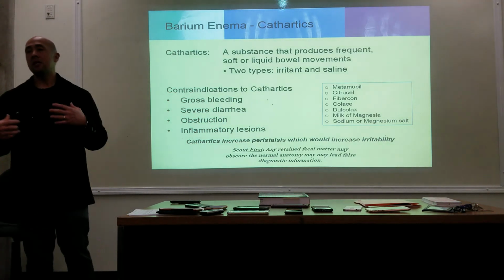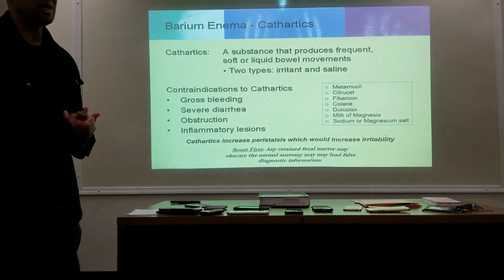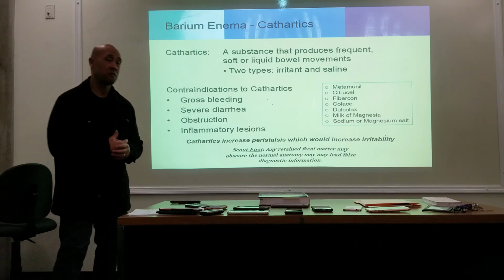So just like in the other exams, whenever you do a fluoro study, you also need to take a scout film. The purpose of the scout film is to what?